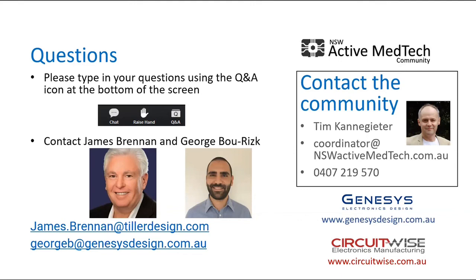Using a smartphone is a crude example. You might have some specific issue occur on your screen based on some other auxiliary operating system things that happen, and then suddenly you lose access to that app during something really critical. Now, of course, that can happen on any device, but when you don't have these auxiliary operating system processes happening in the background that are out of your control, you have more control over the verification and validation of the software that you have running on your device.